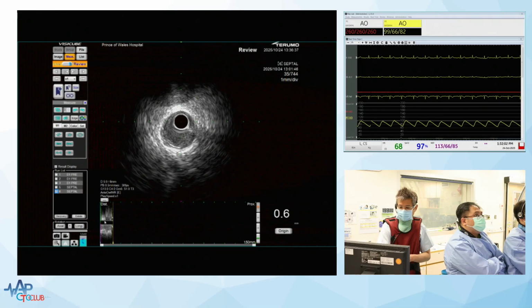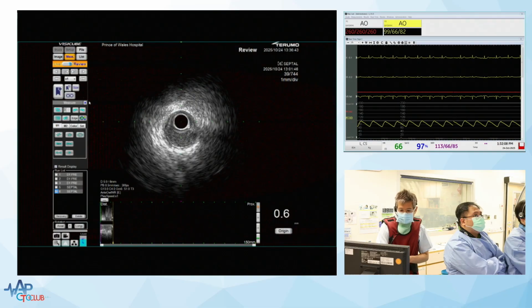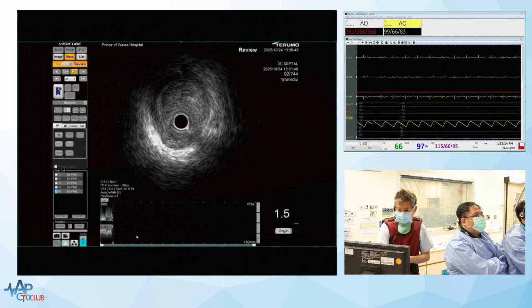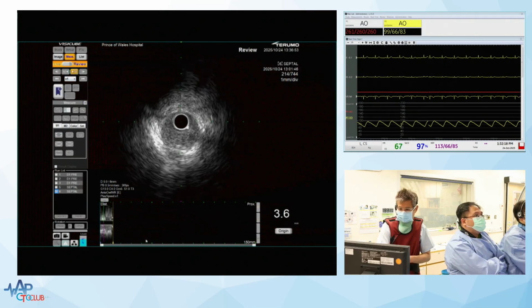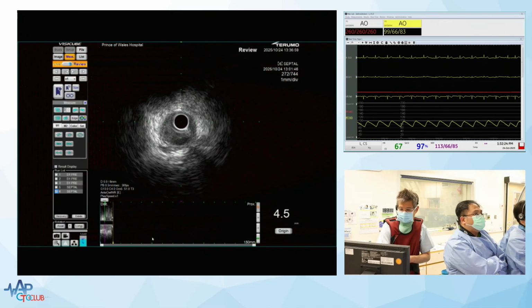Because sometimes you just want to see whether there's any sort of flow or anything in it. Red blood cell speckles. Yeah, yeah. Looks soft. I can't do that. Hold on. Hopefully. Let me see. Yeah, very difficult to confirm the speckles. Very difficult.